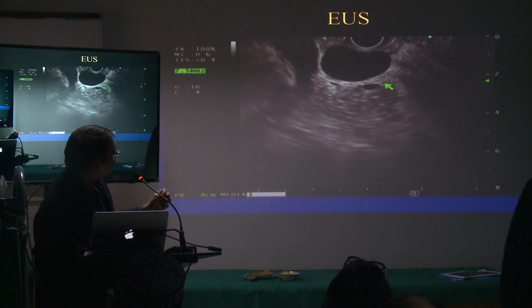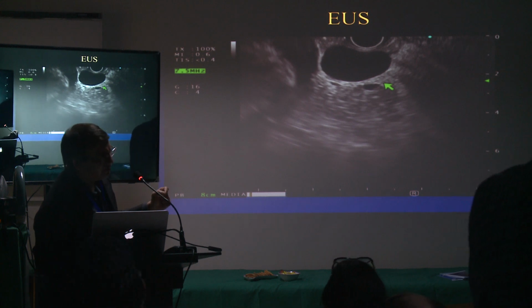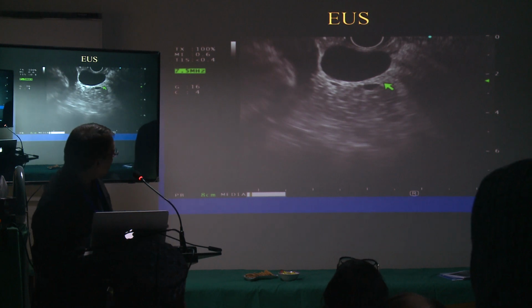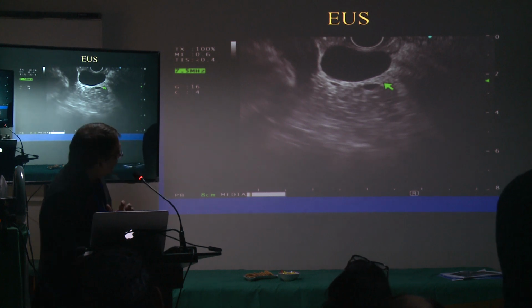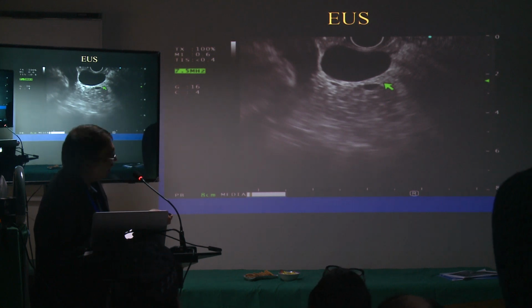Yeah, that would be after the FNA, right? So it looks like a simple cyst, right? I might have a size in there, but you can estimate the size. This is close to 12 millimeters, and if you look here, probably 2.5, something like that. So anything else you see there? What strikes you a little bit? Pancreatic duct dilatation? No, the pancreatic duct looks normal to me.